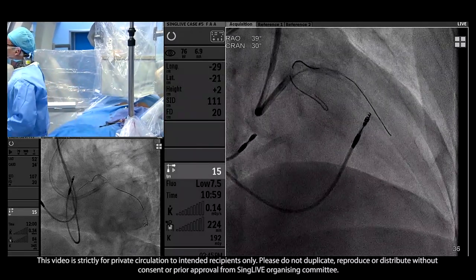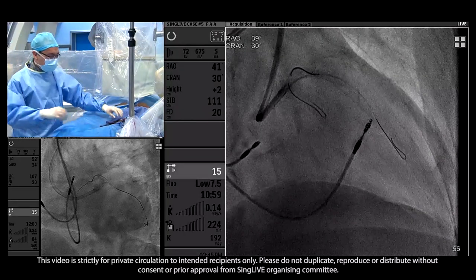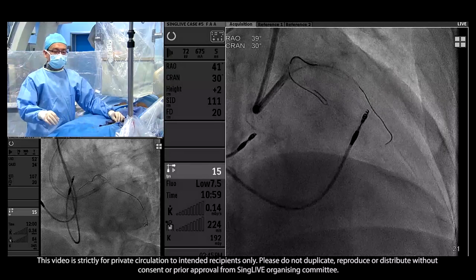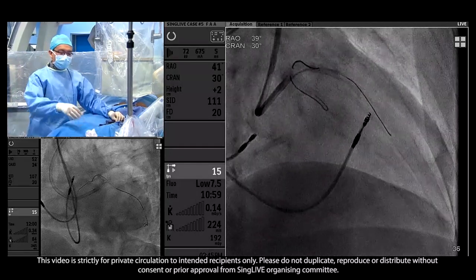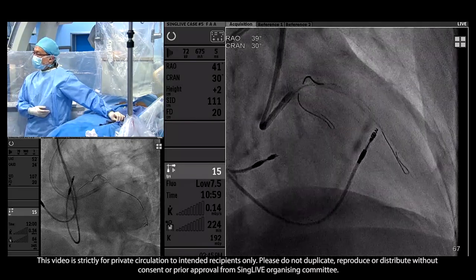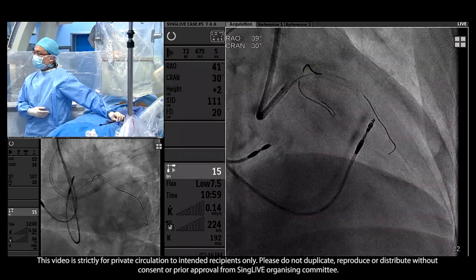Okay, we're having a mini conference here. No, too much shot. But Kaewoon, it is your call, so we are just watching. 12, don't want to cross. If you don't want to cross the OM, 8 is better. Yeah. Okay, we're going for a stent.